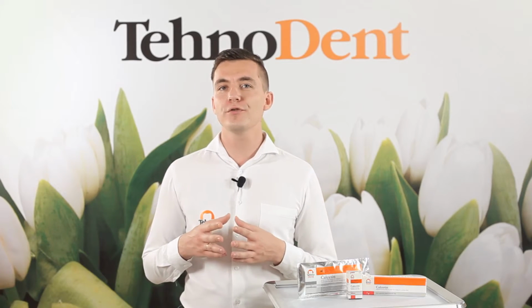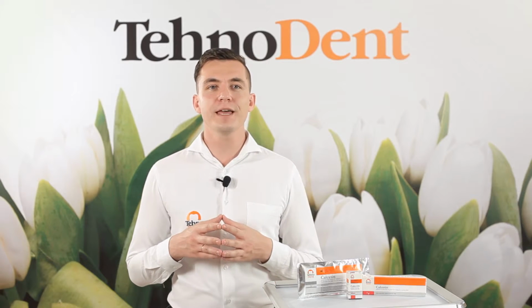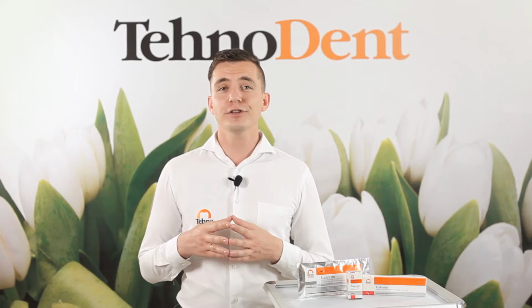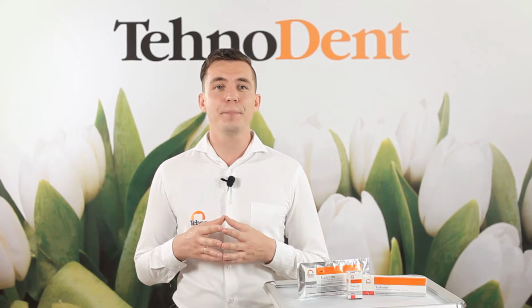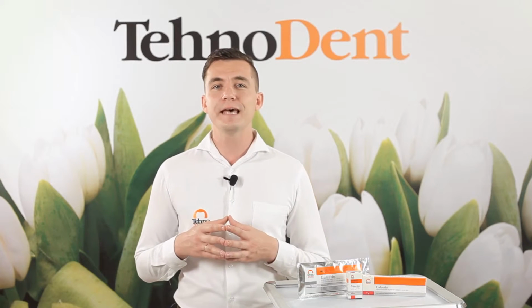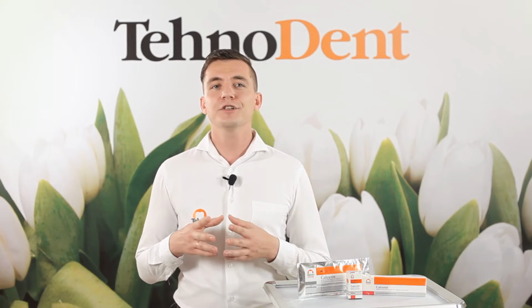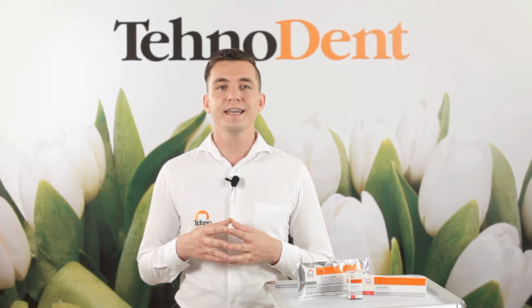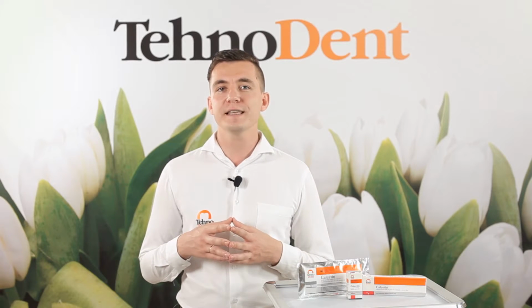For apexification of teeth with unfinished root growth, instrumental and medical treatment of the root canal is performed. In the dried root canal, Calcetin paste for endodontic treatment should be put and then covered with temporary hard cement. The treatment is performed under X-ray control. After 3–4 weeks, it is advisable to replace the paste with a fresh portion.